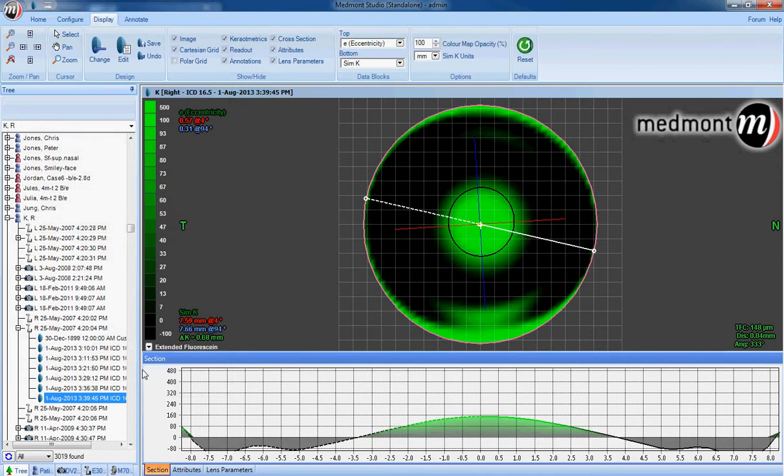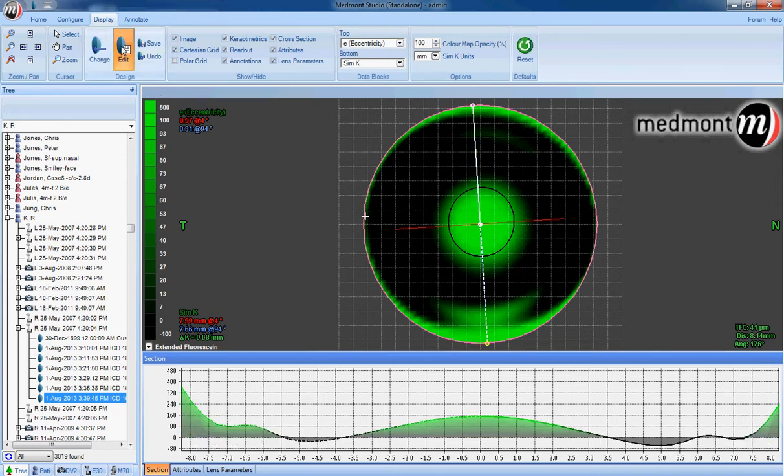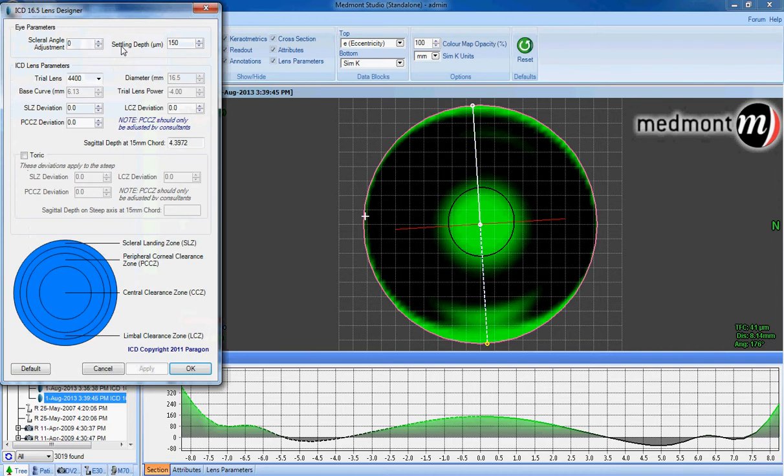After applying that change, you can see how the lens has settled into heavy bearing with the peripheral cornea and the limbus. This lens would clearly have an inappropriate vault through this sensitive area of the eye.